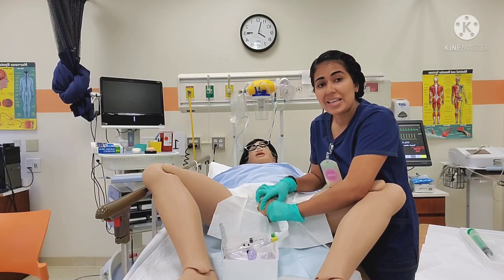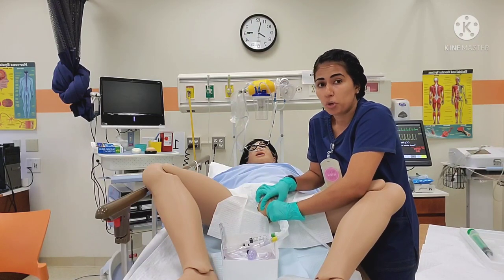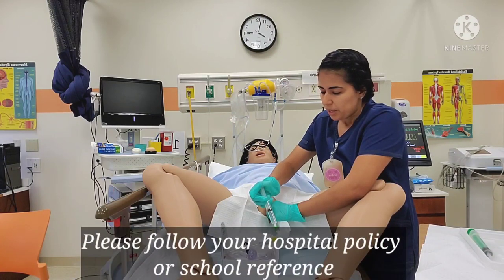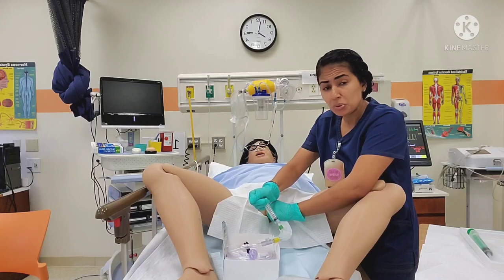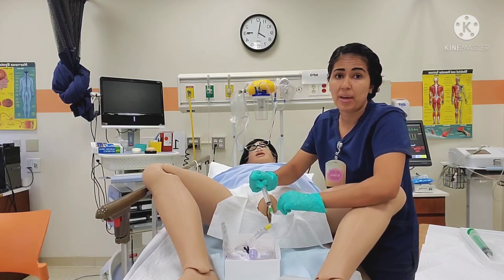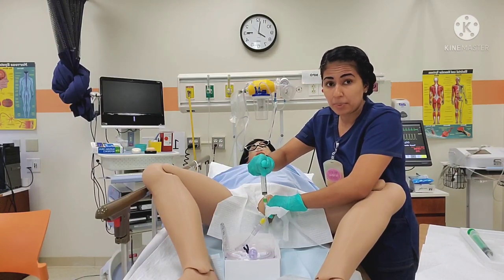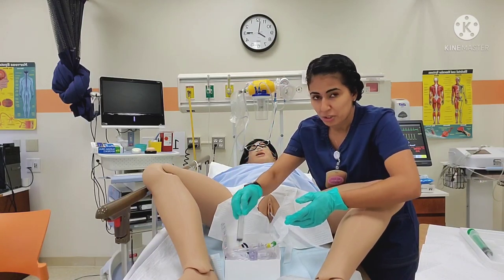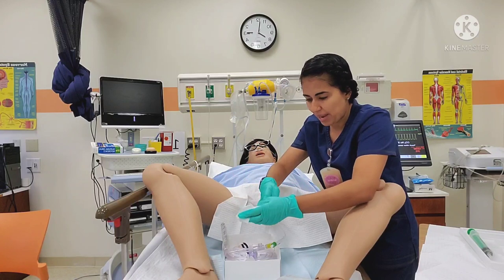Then take your non-dominant hand and secure the catheter while you inflate the balloon. I personally inflate the balloon with my contaminated hand, keeping my sterile hand always on the catheter. My reasoning: if the catheter slipped into the urethra and I feel resistance inflating the balloon, I haven't pushed it further with my sterile hand. Once the balloon is inflated, I do a very soft tug to confirm it's in place, then disconnect the syringe. Don't forget to disconnect — nurses get excited, leave the syringe on, the balloon deflates, and you have to repeat the whole procedure.